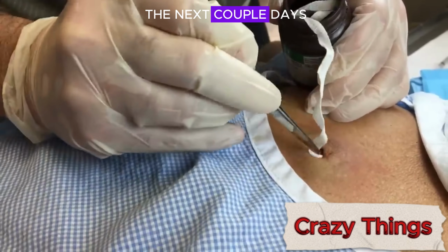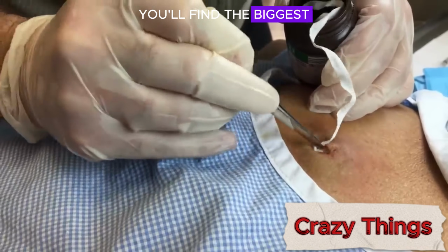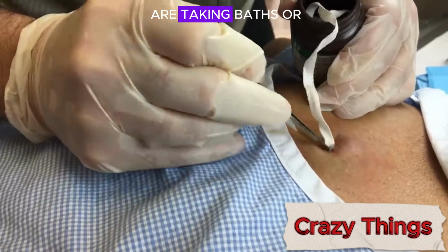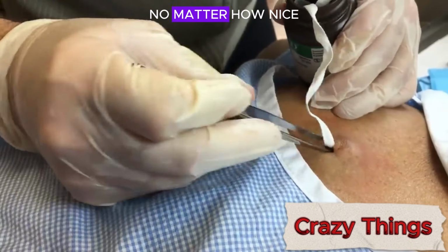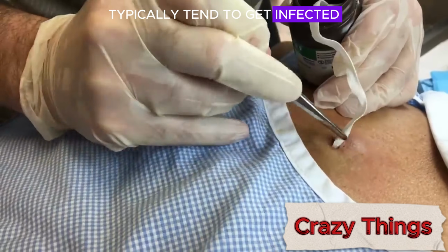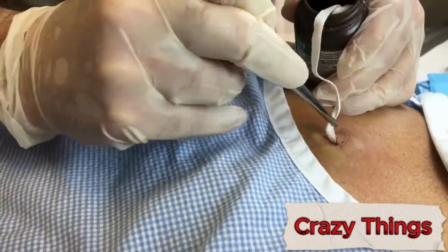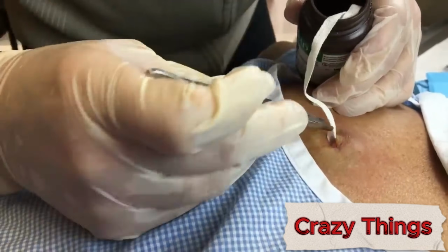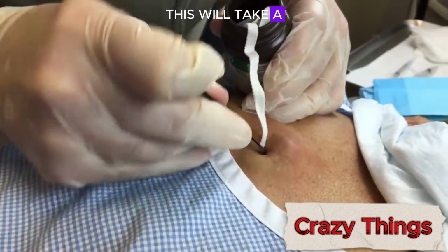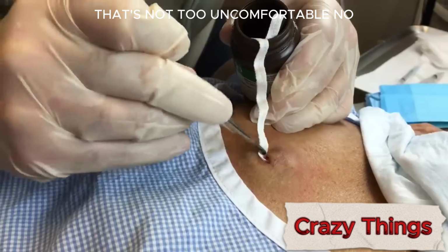So certainly over the next couple days, try and keep this dry if you can. And this is a note to all residents. You'll find the biggest risk of infection usually becomes one of exposure to water. So if your patients are taking baths or taking showers, no matter how nice your technique was when you were doing the procedure, those are the ones that'll typically tend to get infected. And you can see this will take a fair amount of the packing. That's not too uncomfortable, Marie? No.